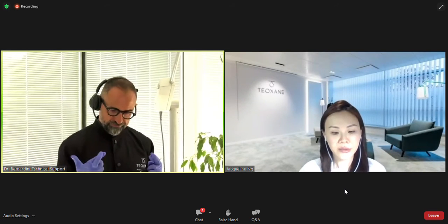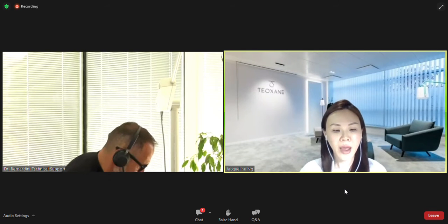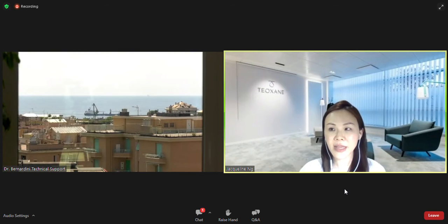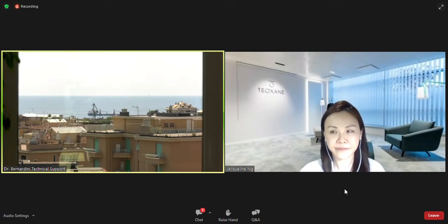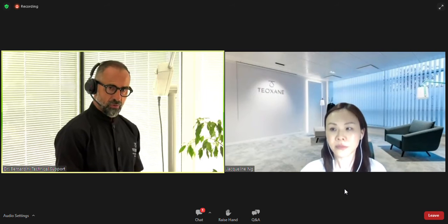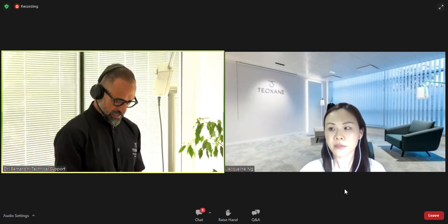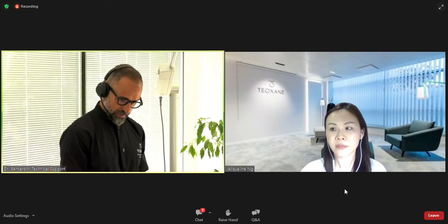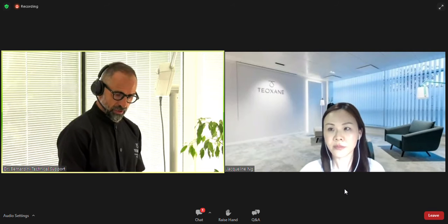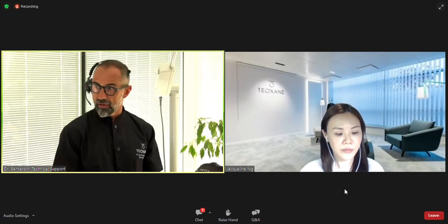Yes. I think just now maybe it wasn't very clear. One of our audience is asking at the G point, was it a deep or a superficial injection? The G point is again very deep, as deep as possible. It is not on the bone, it cannot be on the bone. It will be deep, at the level of the SMAS, deep between the fat and the periosteum.